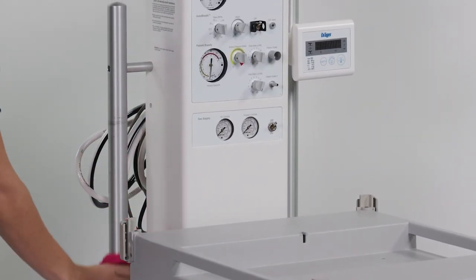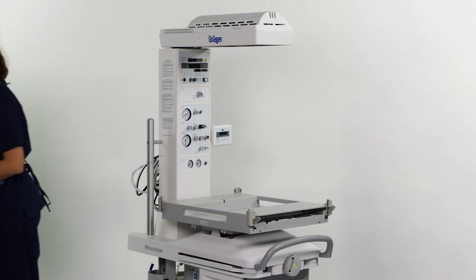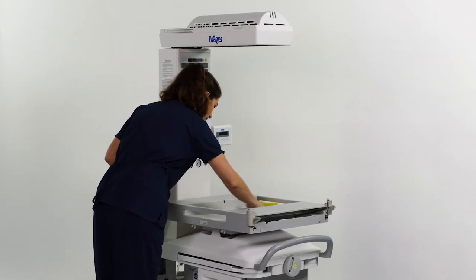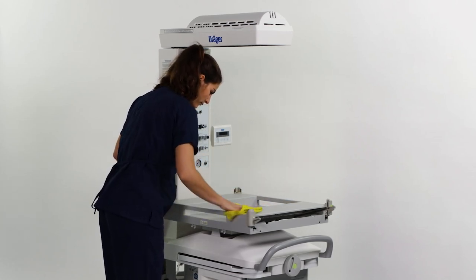Ensure the equipment is not in use and is disassembled. Perform surface disinfection, making sure to clean all holes and indentations. After the contact time has elapsed, remove the disinfectant residues. Wipe with a dry cloth.